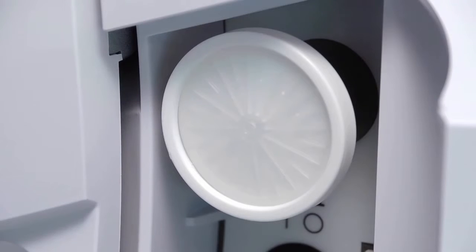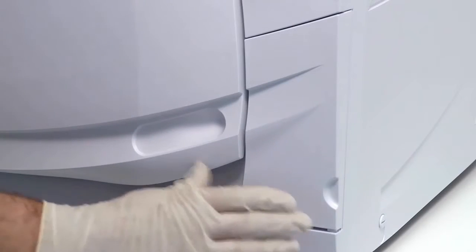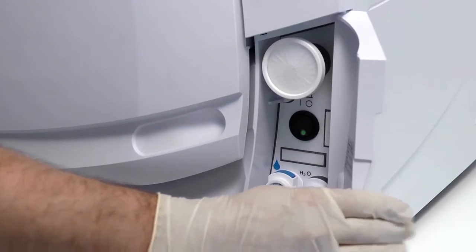The bacteriological filter is an essential component of your W&H Liener MB steriliser. It filters the air entering the chamber when drying the load, ensuring the air does not become recontaminated. The filter can be found behind the service door.